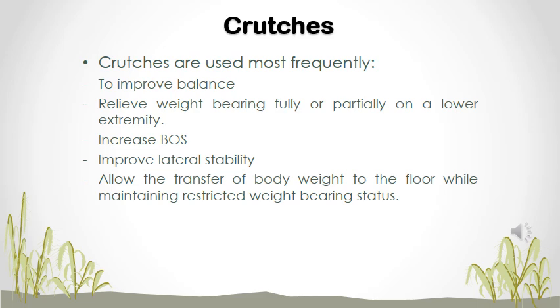We now move on to crutches. Crutches are used most often to improve balance and take off some weight from the injured, affected side, either taking full weight off or partial weight. They also assist to increase the base of support, improve lateral side-to-side stability, and allow the transfer of body weight to the floor while maintaining a restricted weight-bearing status.